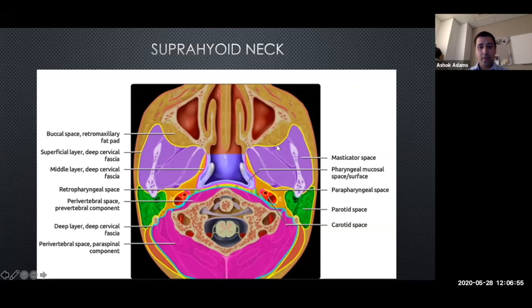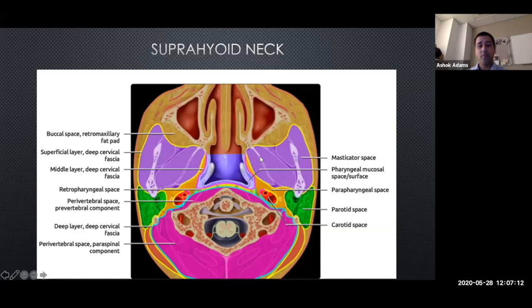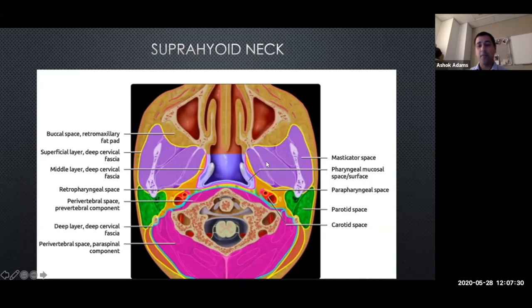Coming out laterally, the purple area - contribution from the superficial layers of cervical fascia - is the masticator space. It does what it says on the tin: all the muscles of mastication - masseter, temporalis, medial and lateral pterygoids. It has a large surface area connection with the skull base. Importantly, the V3 division of the trigeminal nerve freely communicates with it, so tumors can get perineural spread via V3 through the foramen ovale into the intracranial compartment.